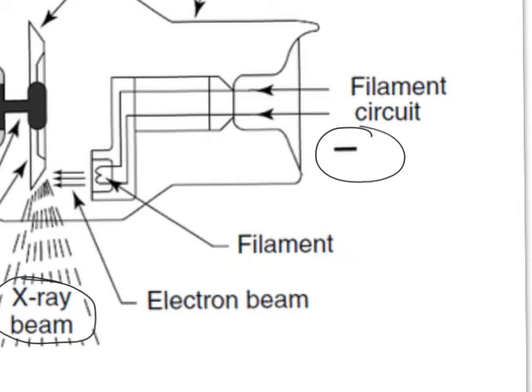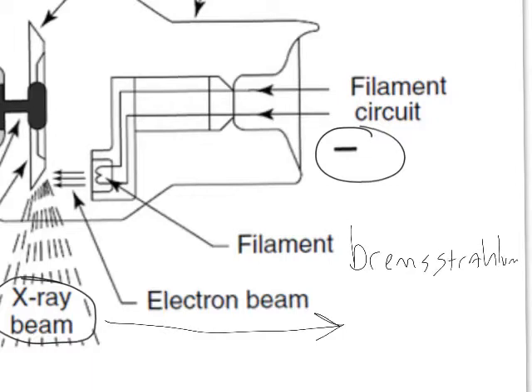So, what I'm talking about as we make these X-rays, right, is two processes. One of them we're going to call Brem, and I think it has two S's or something crazy. I don't remember. It's German. Bremsstrahlung. I'm going to run out of space trying to write it. Bremsstrahlung is stopping X-ray production. The electrons are stopped, and they produce an X-ray. It only happens in the tube. It is an interaction between an electron and the anode. It only happens in the tube. You'll probably be receiving a question about that at some point.